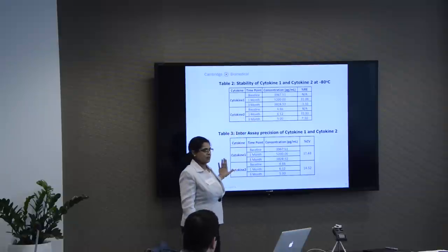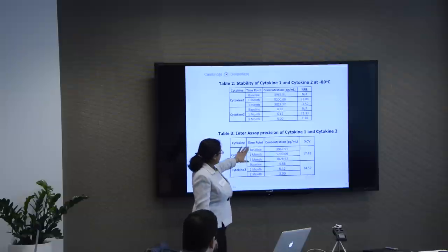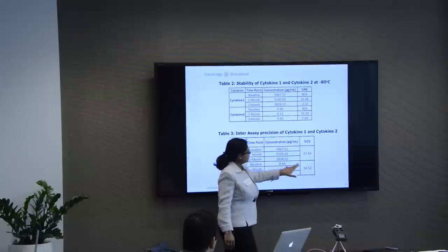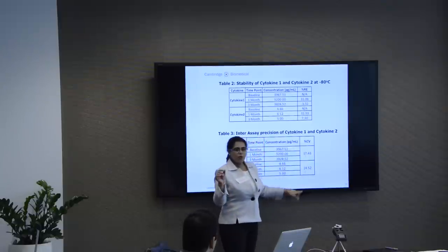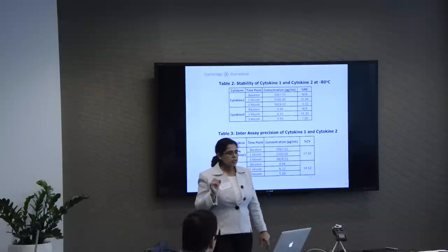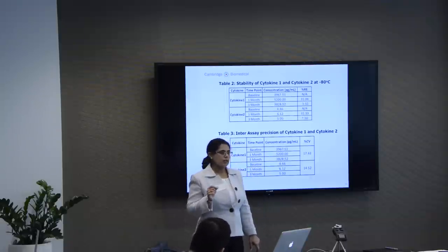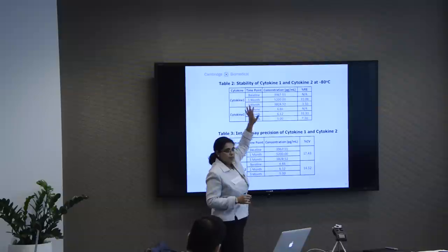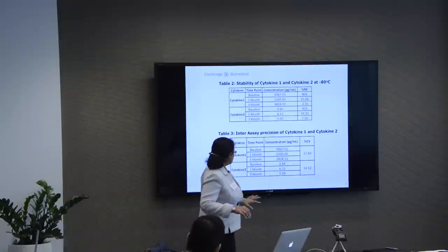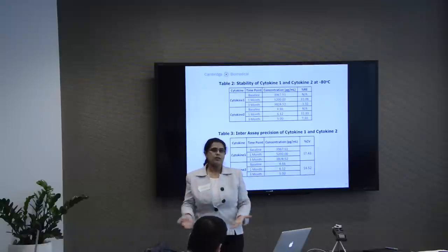But here's the point. Look at the inter-assay precision of cytokine 1 and 2. For all these runs, the inter-assay precision is 17 and 14%. Well within the inter-assay precision, or the variability between run to run, day to day. Stability didn't fail at 1 month. It passed, because you see this variation from run to run, day to day, and operator to operator.